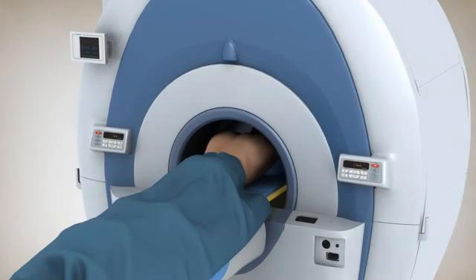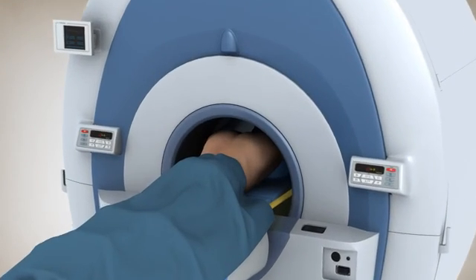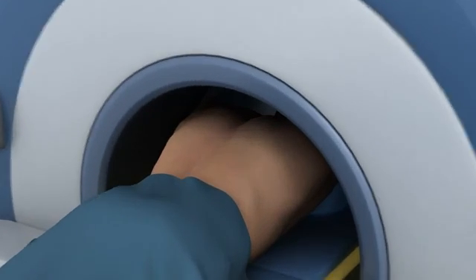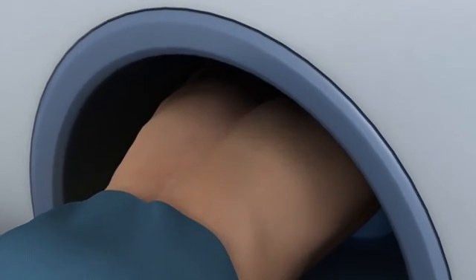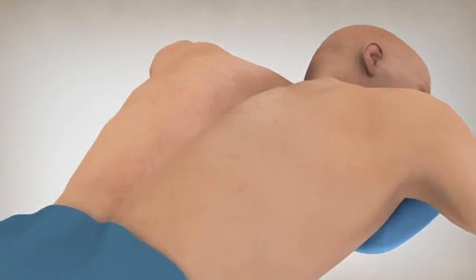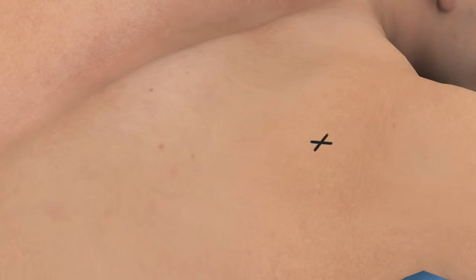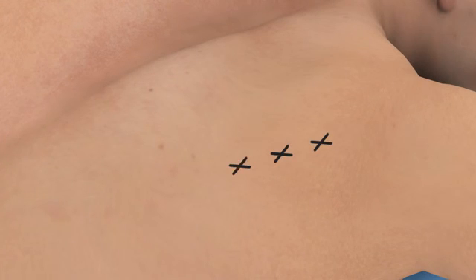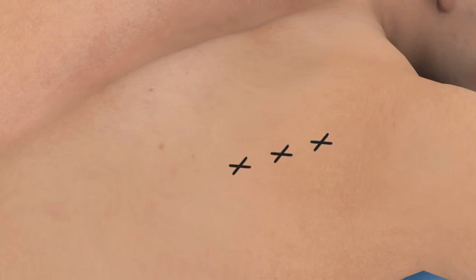EndoCare Incorporated's CryoCare CS system is cleared for freezing of nerve tissue in pain management. For freezing intercostal nerves, the patient is placed on the CT bed in a prone, head-first position. The skin is marked based on the angle determined to be the most appropriate for cryoprobe insertion.